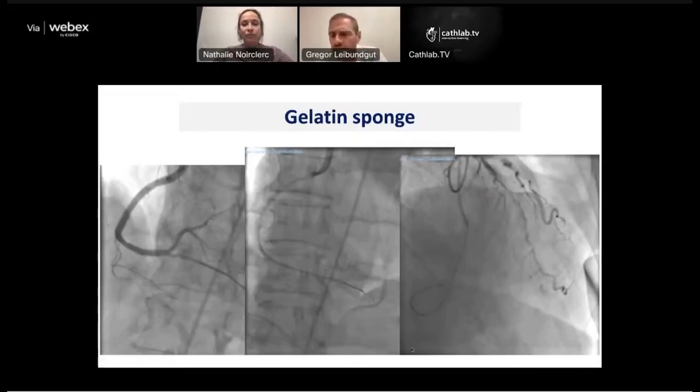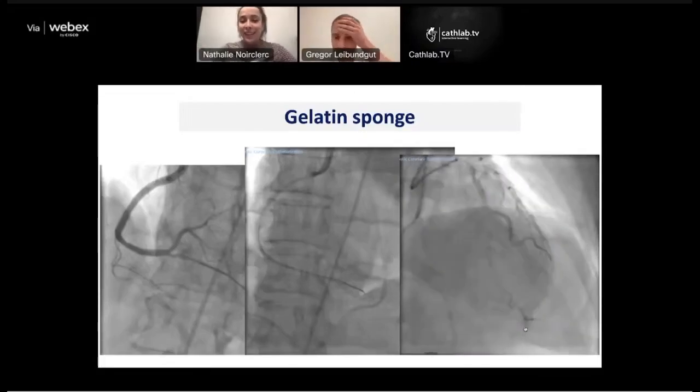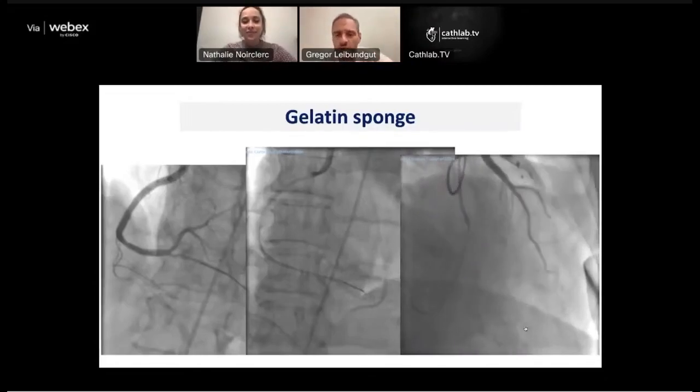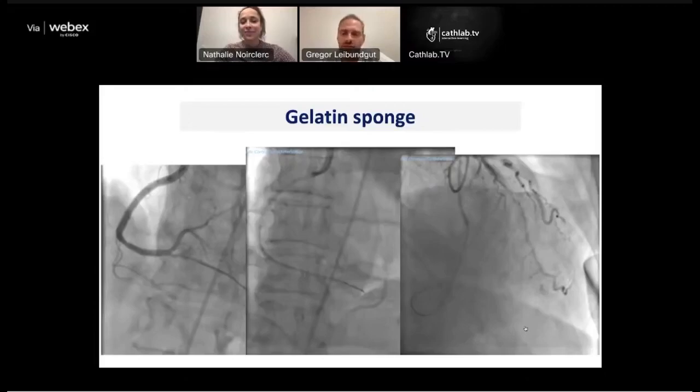And the third or sixth idea, he could just put back the thrombus that he aspirated into the vessel. It would also occlude. Yeah. Maybe, can be an idea. Okay, but this is the more recommended way. This is the other thing that can happen: you occlude the proximal entry into the vessel that is distally perforated, and it's occluded, but unfortunately you have a collateralization. And remember, this vessel was initially occluded, and it came completely retrograde through septal collaterals.